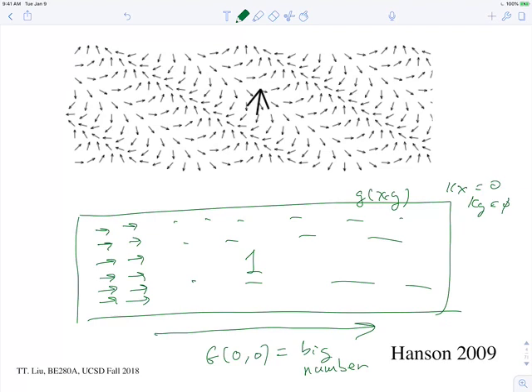Now, let's say I move to some other place in k-space. If we look at this pattern here, what is the predominant spatial pattern of the spins now? Is it vertical, horizontal? It's diagonal, right? So you can see that these spins are all going in the same direction as these spins. So that's got a diagonal variation of the spin phases across my object.